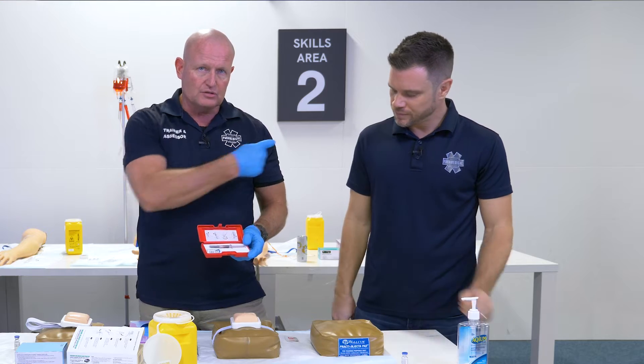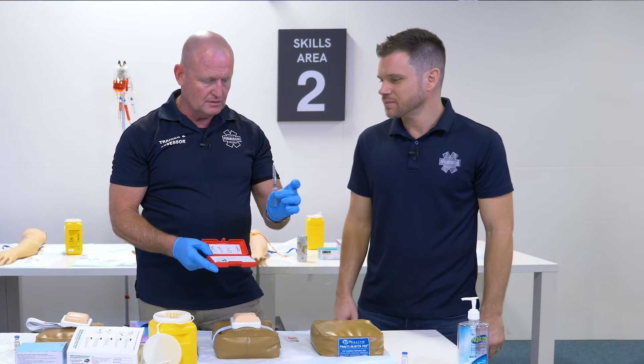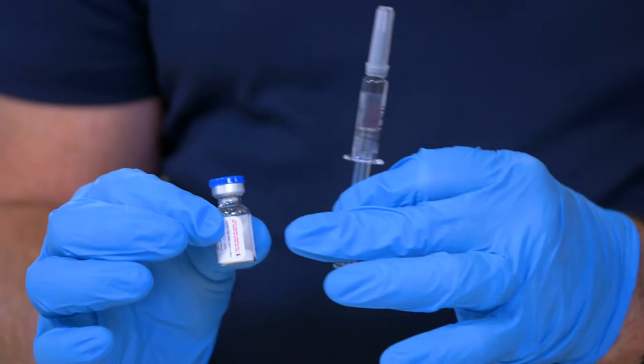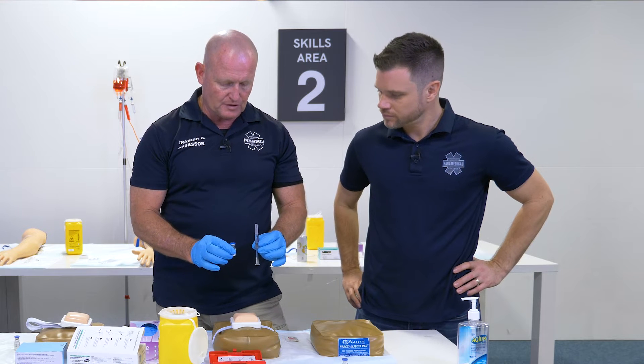This is going to be going into the deltoid muscle. There are two components: the syringe, which just contains water, and the actual drug — that's the glucagon. We will have gone through the five rights, which we'll explain in more detail when you come into the workshop.